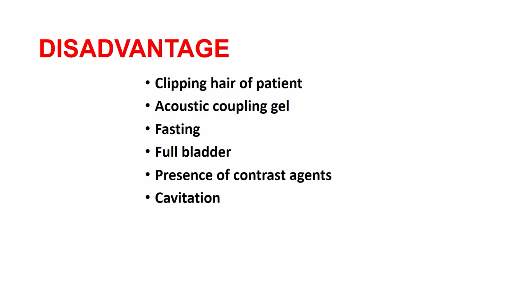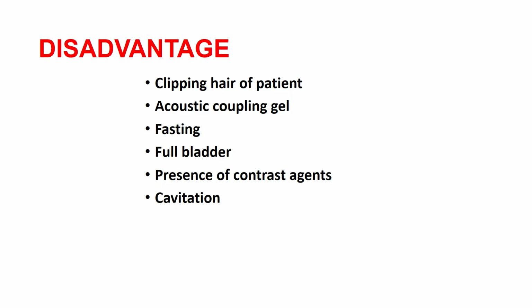Fasting is required in animals, and anesthesia should be given if needed. A full urinary bladder is also one of the major requirements for scanning. Contrast agent is one of the disadvantages. Cavitation in the organ is recorded in continuous ultrasound.